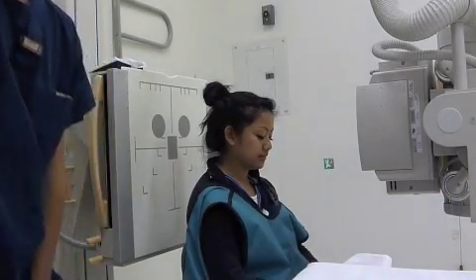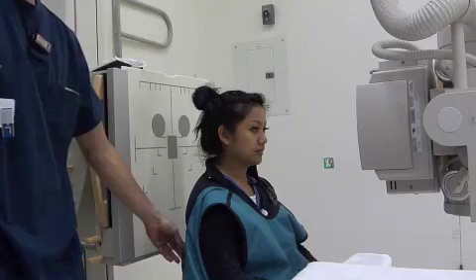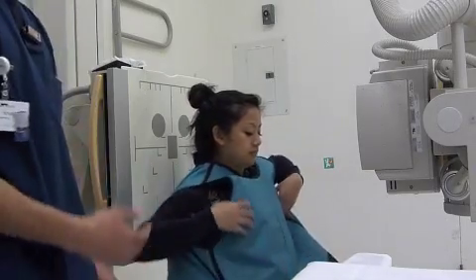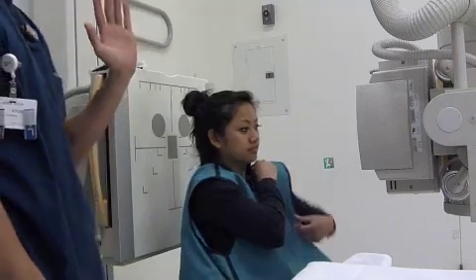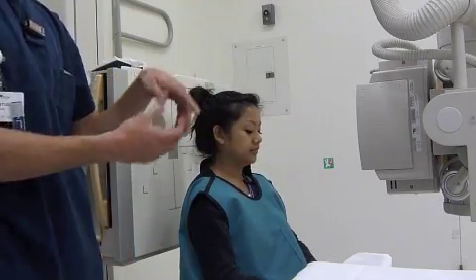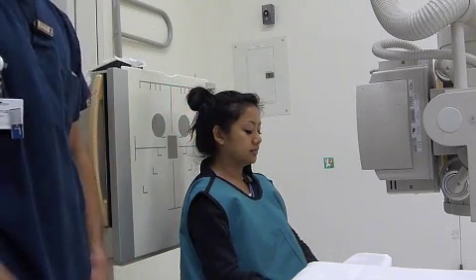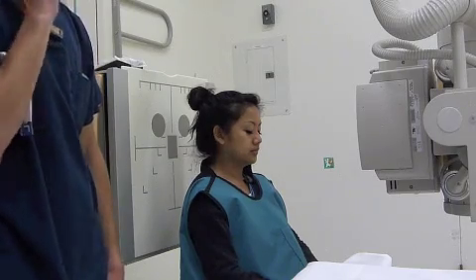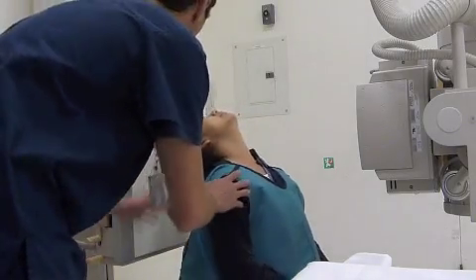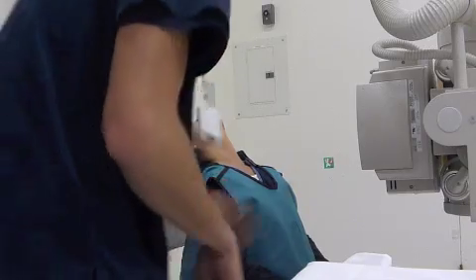I will now be performing the SMV view for the sinuses. I have the patient seated in front of the IR. I've switched the shield around so it's not covering the front. I will have her tilt her head back so that her IOML will be parallel with the IR. I have my tube at 40 inches with a cone on it coming in perpendicularly to the IR and entering 3/4 inch anterior to the EAM. So, could you now put your head back for me all the way and touch the film? A little bit up, just like that. Perfect.